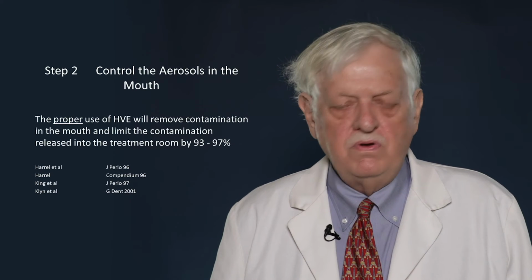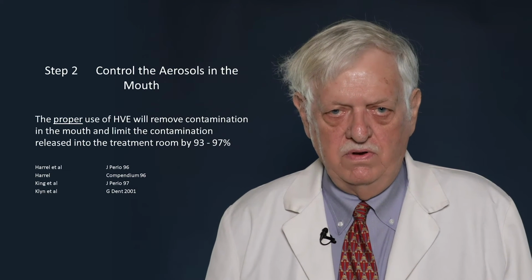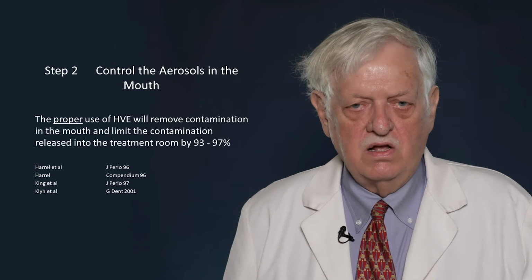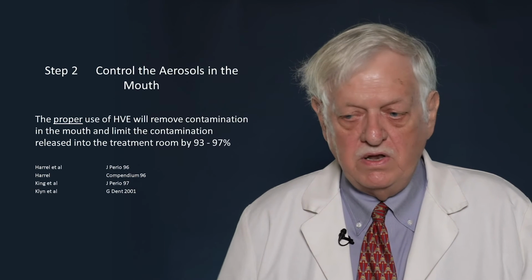Now, what this will do is reduce the viral load. It will not eliminate the viral load, which brings us to step number 2. Control the aerosols in the mouth. Don't let the contaminated aerosols get out of the mouth. How do we do that?